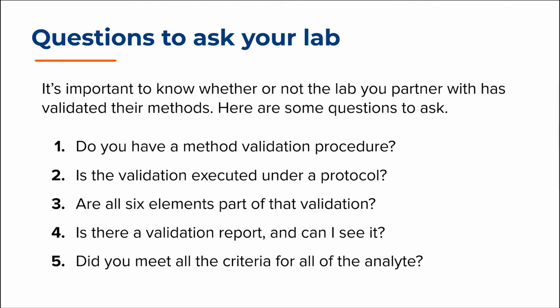The first question I would ask is, does the lab have a method validation procedure? The method validation procedure will establish that the lab has a recognized process of method validation, which ensures validations are performed in a consistent manner. The second is, was the validation executed under a protocol? Again, this is a demonstration of the lab's understanding of the regulatory requirements of method validation for GXP purposes. Third, were all 6 elements part of the validation? This ensures that the method has been fully explored under validation and is fit for purpose.